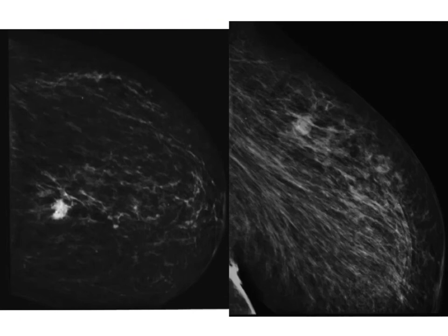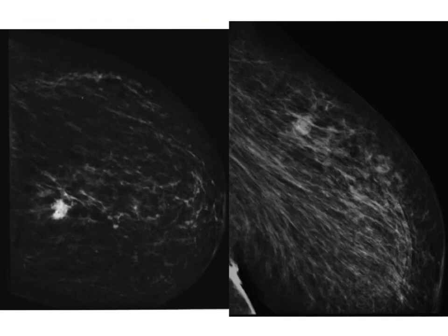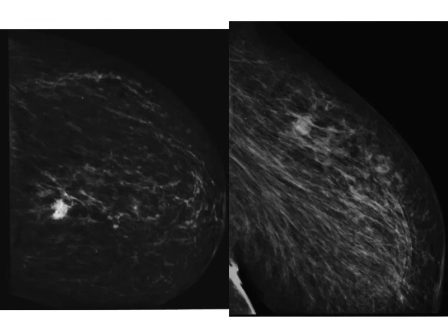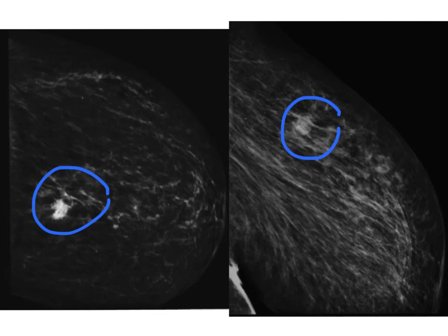The post-clip image confirms the clip has been deployed in the biopsy bed. We then remove both the clip and coaxial introducers, hold pressure, and review post-procedure instructions with the patient. We then perform a post-procedure mammogram, looking to confirm: first, that we appropriately targeted the area in question; second, that our clip deployed; and third, the location of the clip relative to the target. In this example, the post-biopsy changes and clip are in the appropriate position in the central and superior left breast, confirming we sampled the correct calcifications and that the clip deployed in the area of the biopsy.